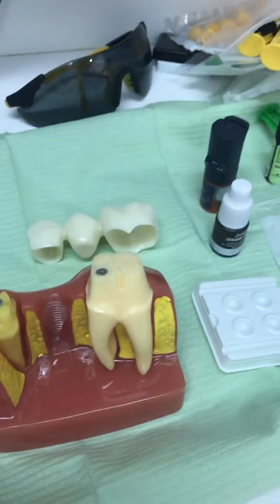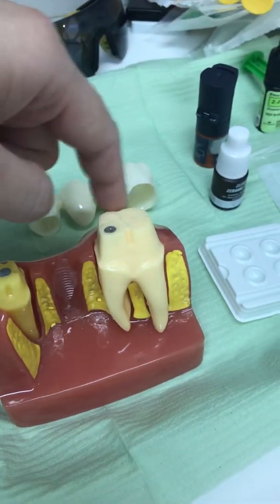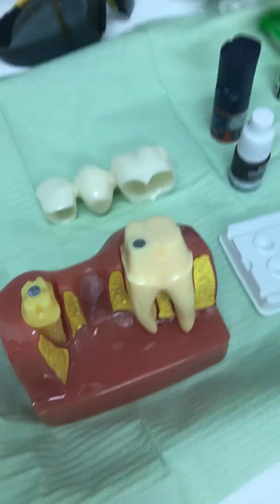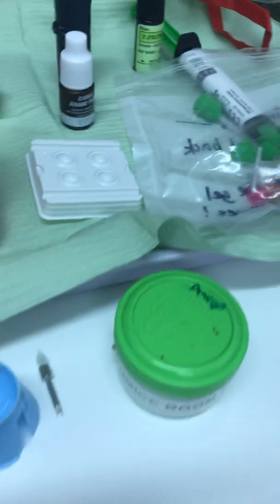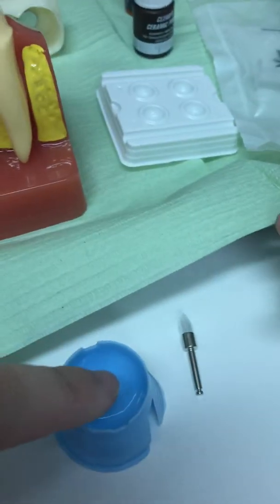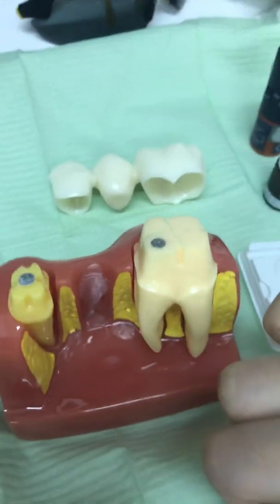Generally we start by taking the temporary crown out, as I've just done. We will do a bit of pumicing around the teeth to make sure the tooth is clean and free of any residual bacteria. We make it into a slurry of pumice so you can brush it on.